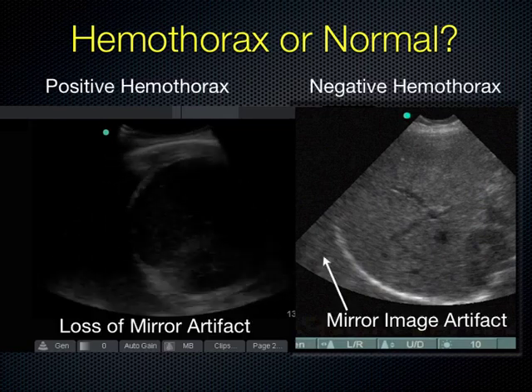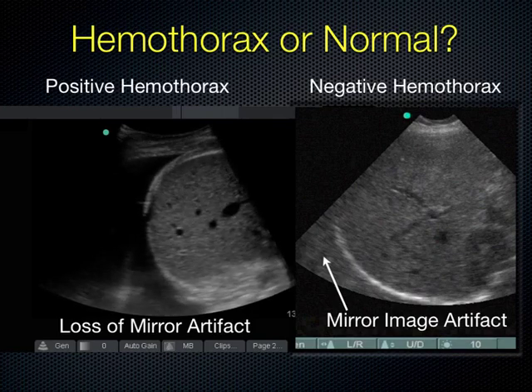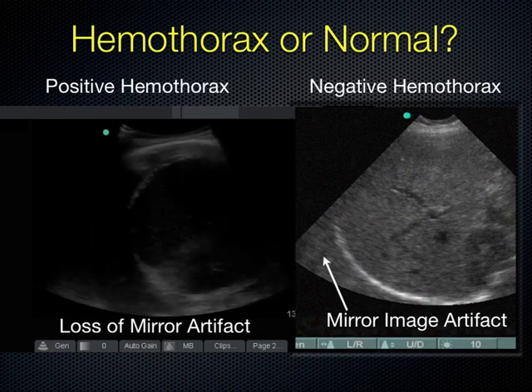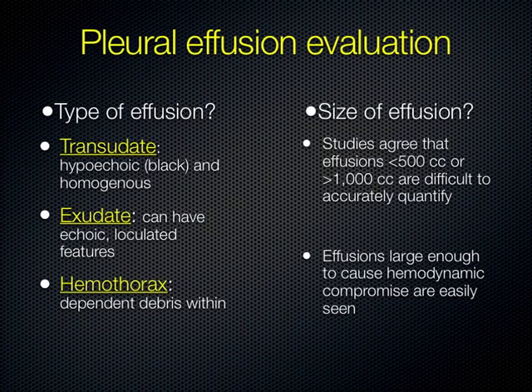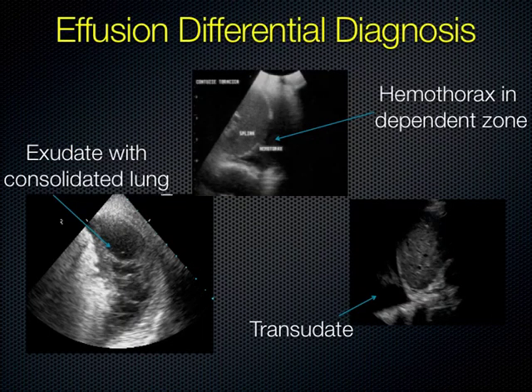Sometimes you can tell the nature of the effusion, and it guides management. If you're thinking about putting a thin needle in for thoracentesis, you might not choose that if it looks like thick fluid with fibrinous loculations or blood — you need to manage those differently. You should never definitively say transudate versus exudate based on ultrasound alone — send it to the lab to be sure. But you can pretty much tell when you look at it whether you'll need a needle or a chest tube. Notice on the transudative image, you can see the spine shadow behind the fluid — that's the spine sign.